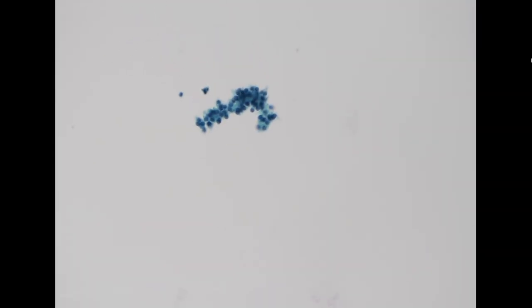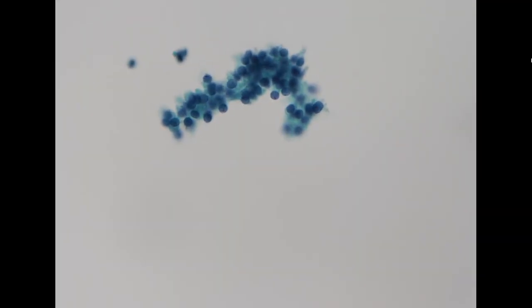So the diagnosis depends on the cellularity. If the cellularity is high, and you can also see, for example, larger fragments with fibrovascular stroma, it is likely to be a follicular neoplasm. In that situation, we will sign it out as TBS4, suspicious for follicular neoplasm.